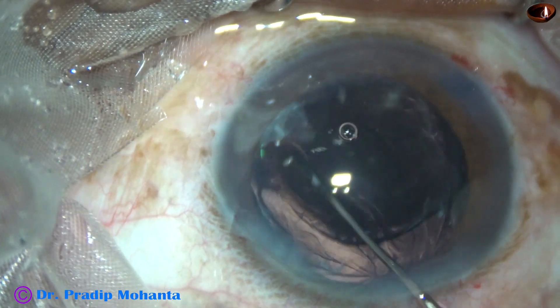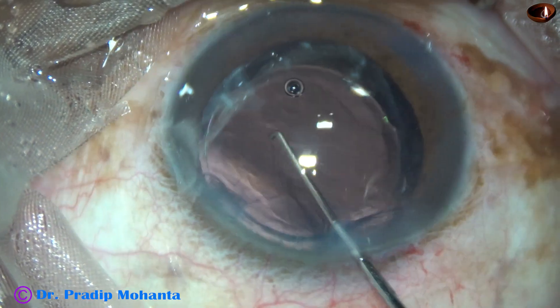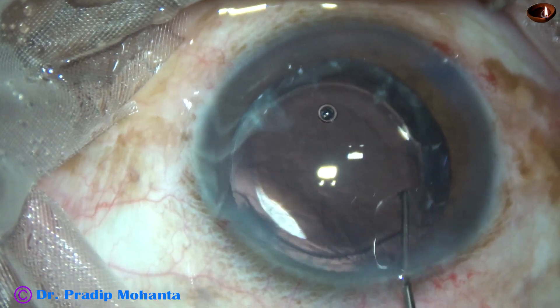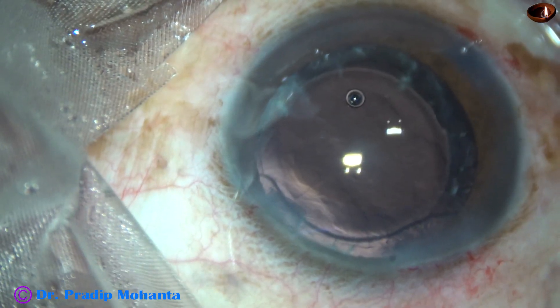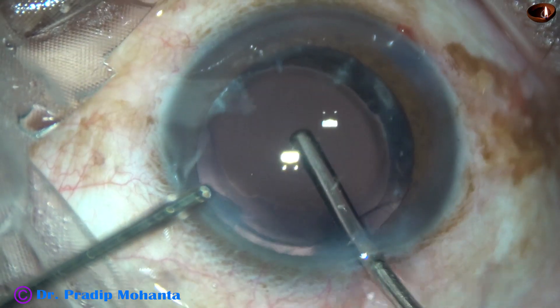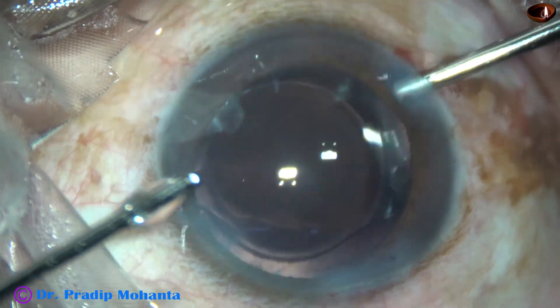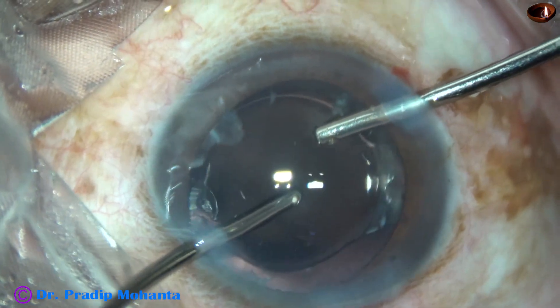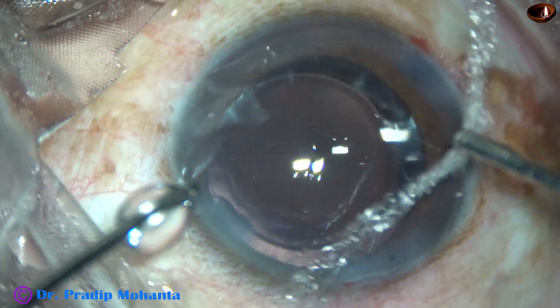Flipped the nucleus. Flipped the intraocular lens and placed the lens in the capsular bag. Viscoelastic was cleaned nicely. We are towards the end of this surgery. Viscoelastic was cleaned nicely with bimanual irrigation aspiration.